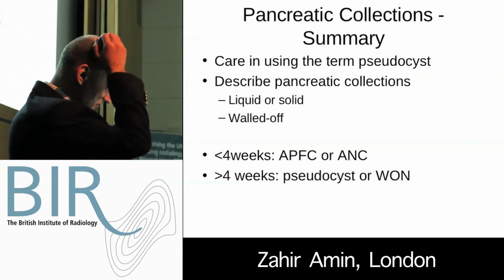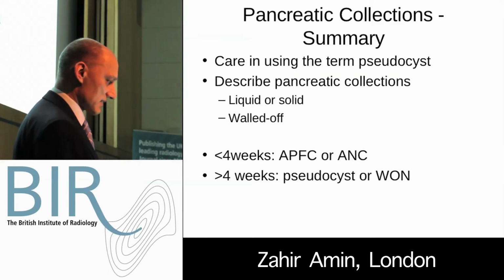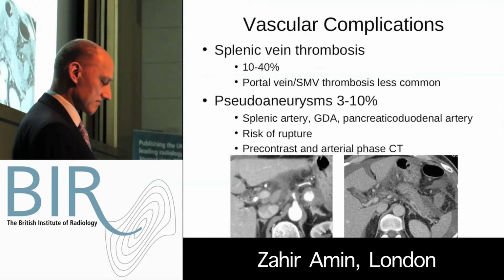So, just to summarize, we have to describe collections as liquid or solid. Are they walled off or not? Less than 4 weeks, the two terms that should be used are acute peripancreatic fluid collection or acute necrotic collection, and then after 4 weeks, pseudocyst or walled-off necrosis.